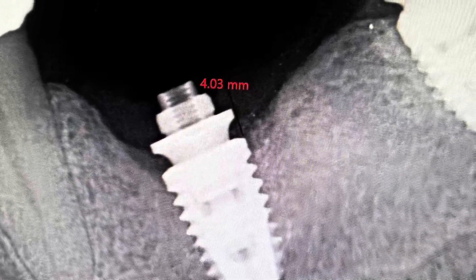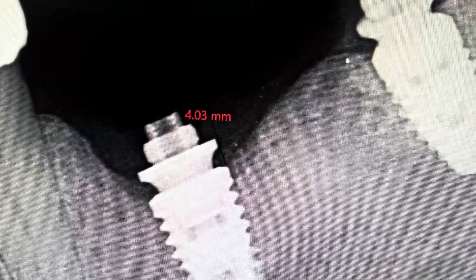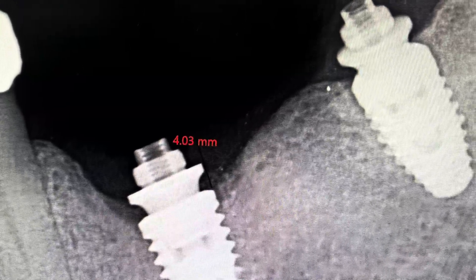You can see here on the X-ray that this is actually the way it is. So when we put the multi-unit on itself we get this vertical soft tissue that helps to protect it.